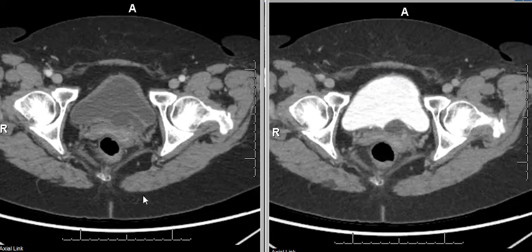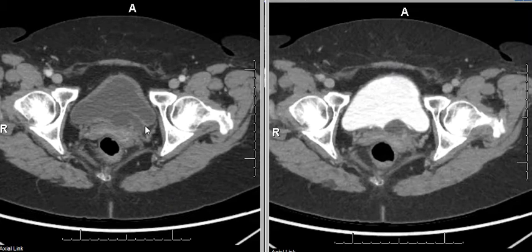This is an axial CT scan in a female patient with lymphoma. What you can see here is a ureterocele. A ureterocele is a cystic outpouching of the distal ureter into the urinary bladder.